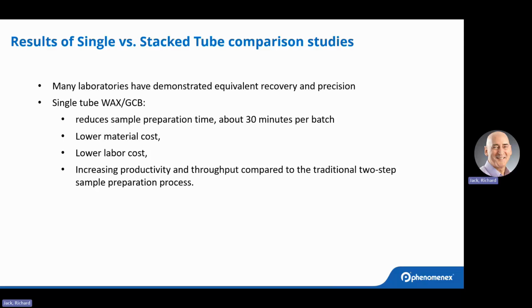And it also reduces a lot of sample prep time. That's going to be about 30 minutes per batch of samples. It's going to lower material costs and also lower labor costs. And it will ultimately increase productivity and throughput compared to the traditional two-step approach to sample preparation.